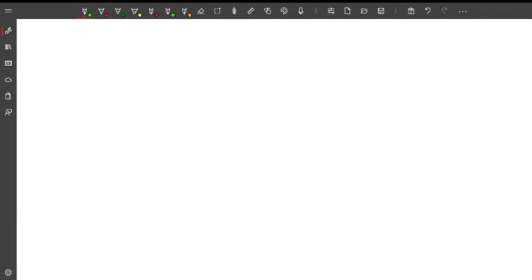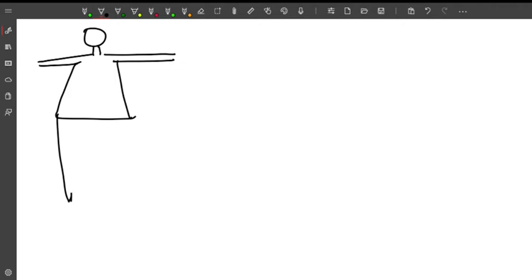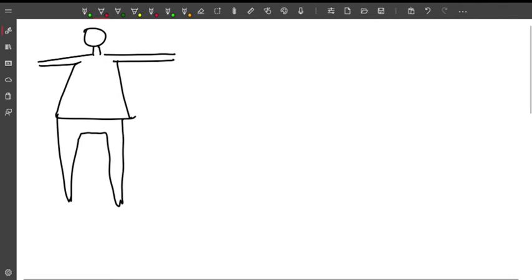So since you are having problems with actually imagining how the ECG machine physically looks and works, what electrodes are used, and also with determining the cardiac axis and understanding axis calculation, this is the video regarding that. So let me explain. Suppose this is a human being, with the heart at the center.